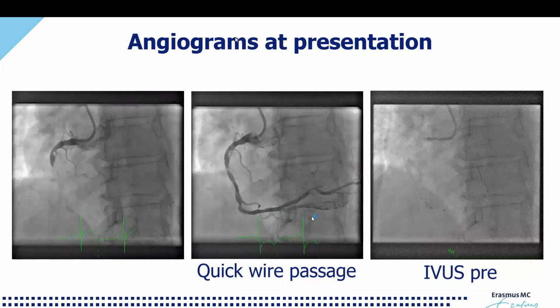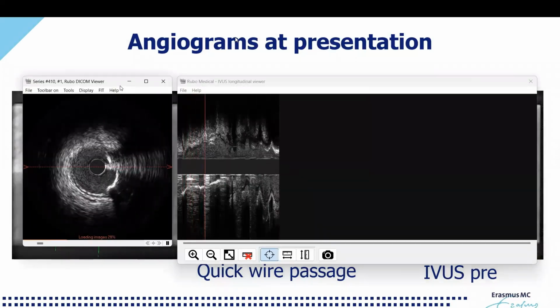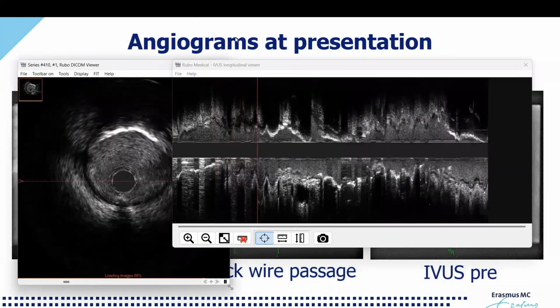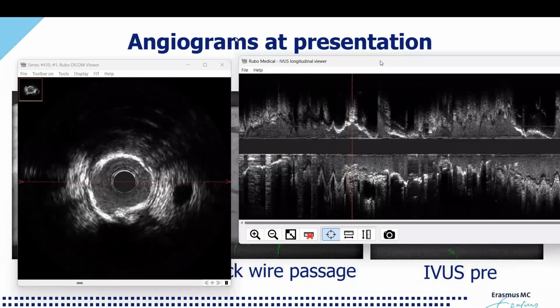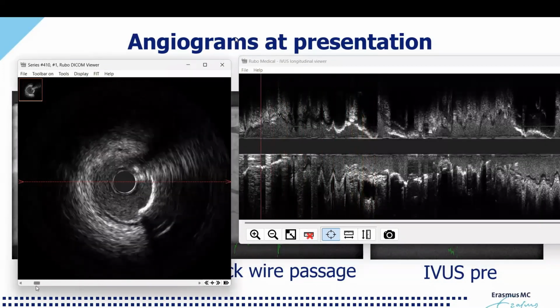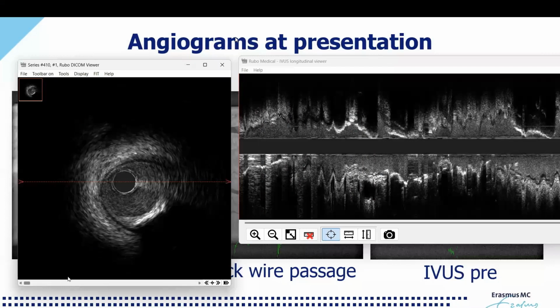And also this was a pity because I hoped to put that in the system of ACIST, but it was just too large. It didn't allow. But anyway, I think we're okay. This is a 2.5 millimeter pullback. Now let's start distal in the right. Again, you see that we already start with calcification. You recognize it now, the bright one with the shadow in there, some softer fibrofatty tissue on this spot.